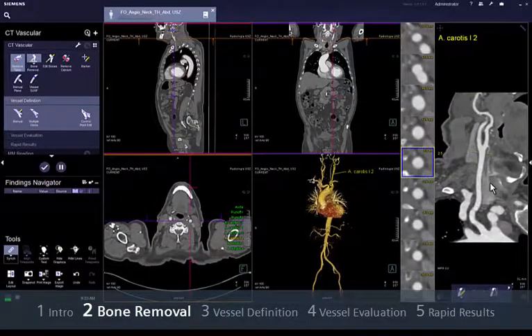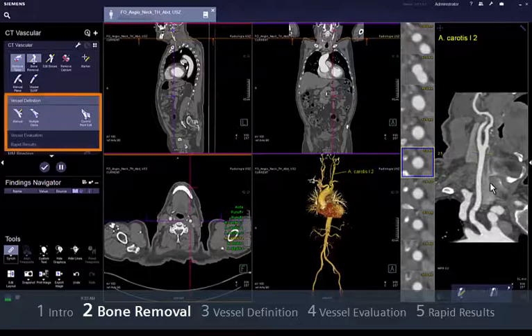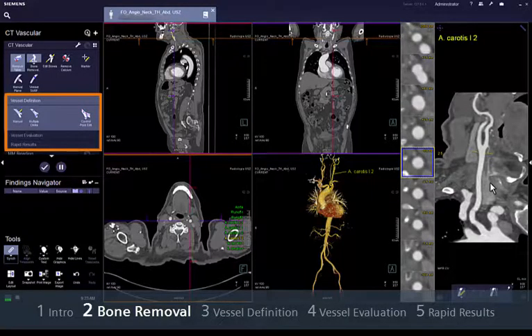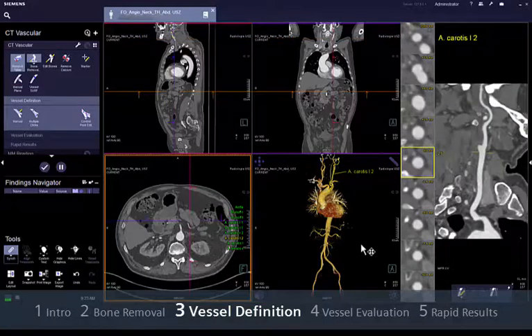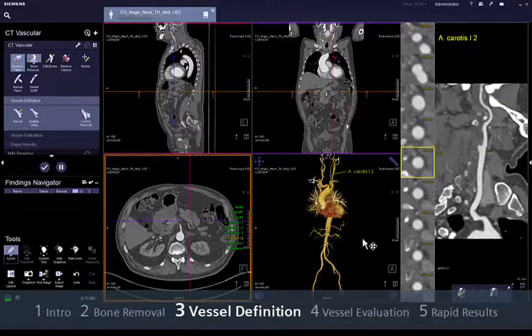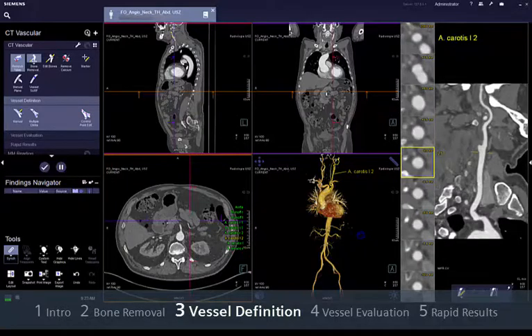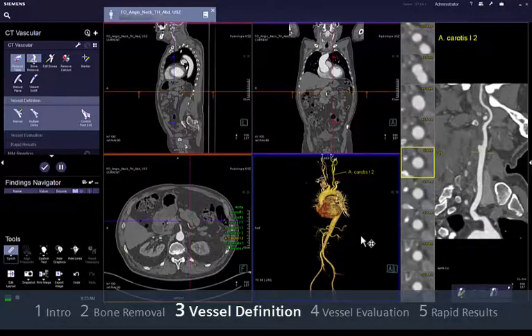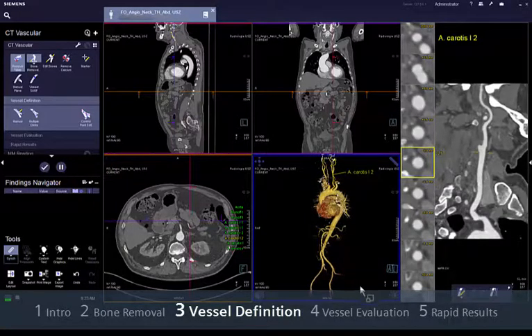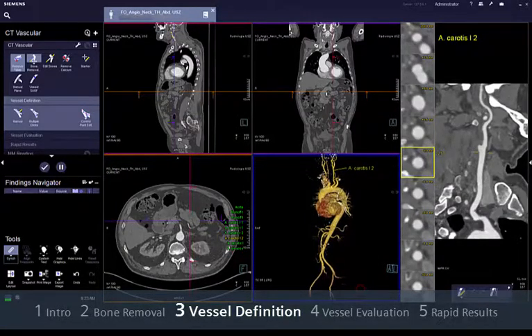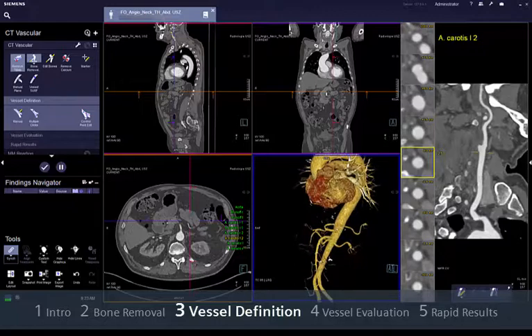In order to facilitate your workflow, Syngovia automatically structures your procedure into different workflow steps. In the Vessel Definition step, you can find a set of semi-automatic and manual tools in case you need to correct centre lines or create additional centre lines.